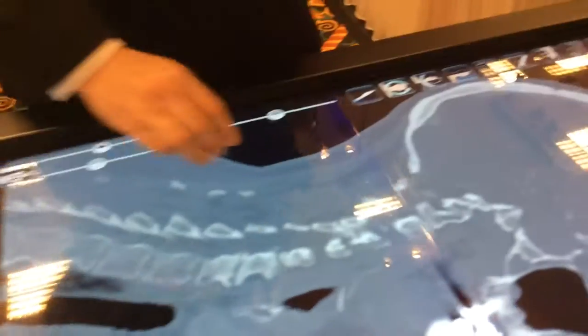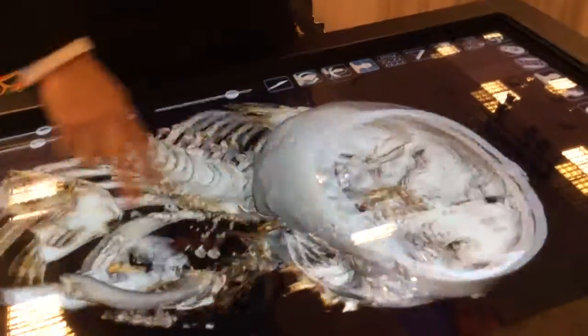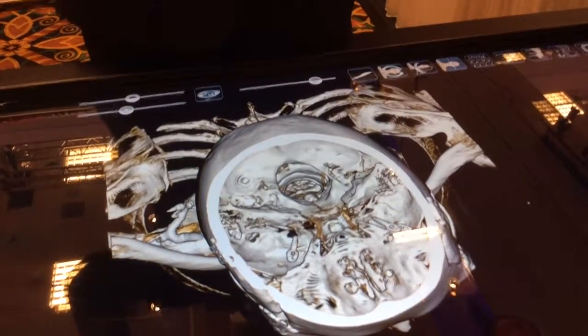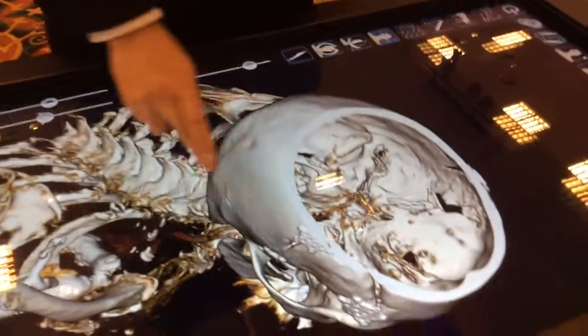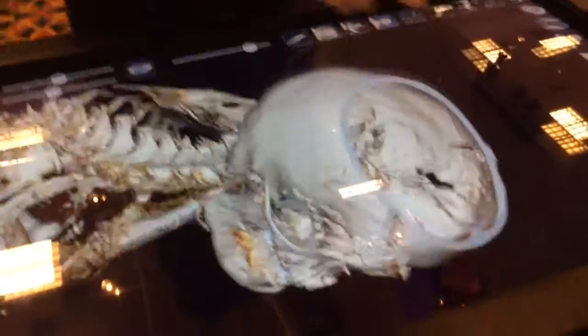So you keep saying clips. What do you mean by clips? These are aneurysm clips that they attach to the blood vessel that is close to bursting. Just a surgical device that they leave permanently inside the skull. I didn't know that.